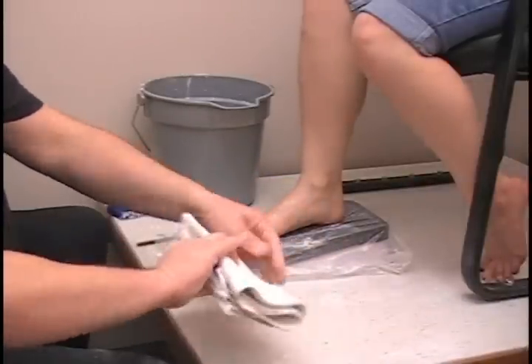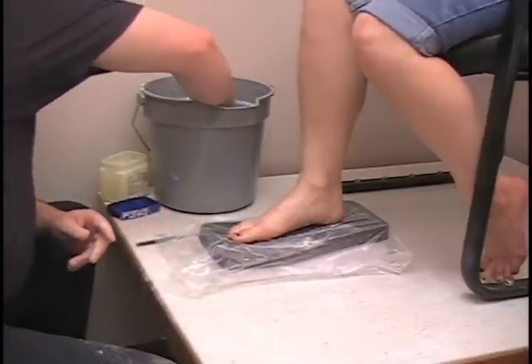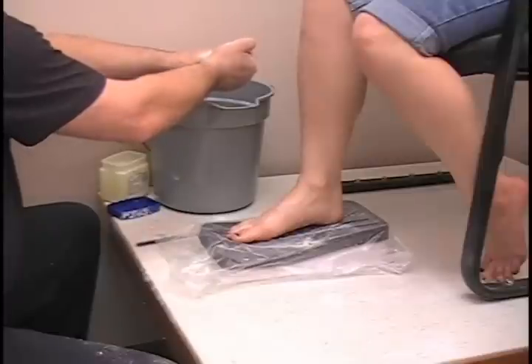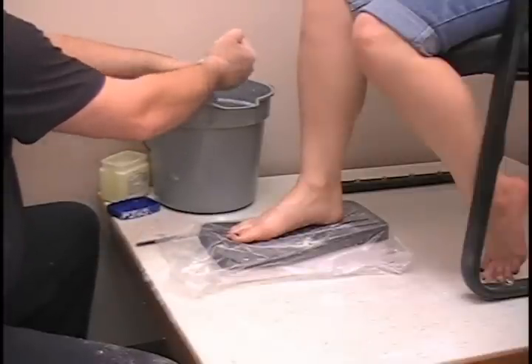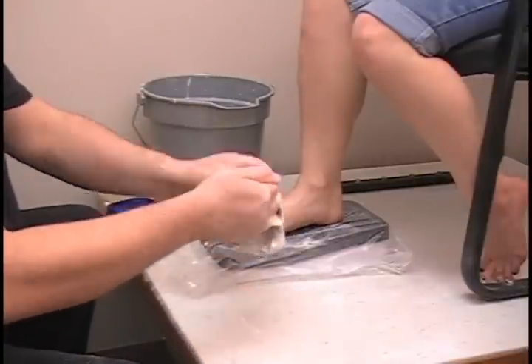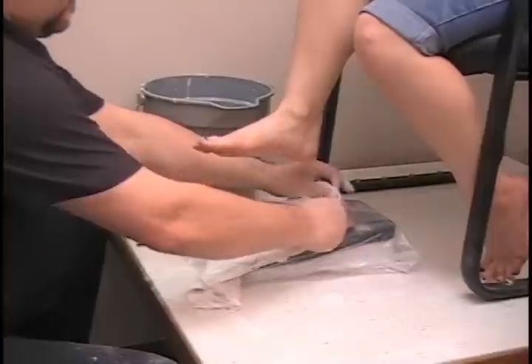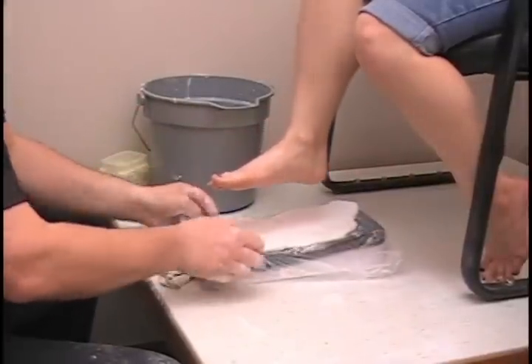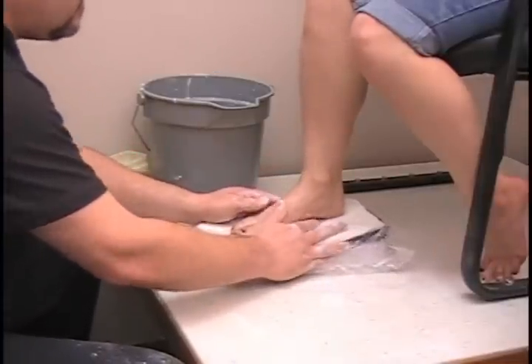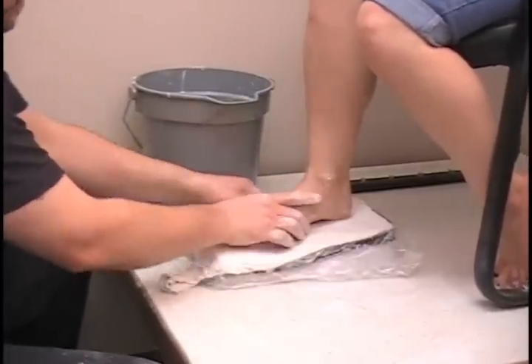Wrap the back piece up — one, two, three, four — then put it in your warm water and make sure you wring it out nice and good, just like a wet rag. Work the plaster in for just a second, then unravel it: one, two, three, and four. Ask the patient to pick up their foot and place it onto the casting block. Set the patient's foot back down, making sure we have it in a 90-90 position and just about in the center of the plaster.